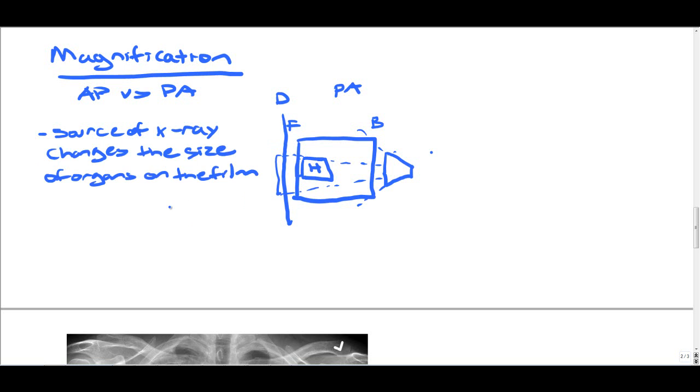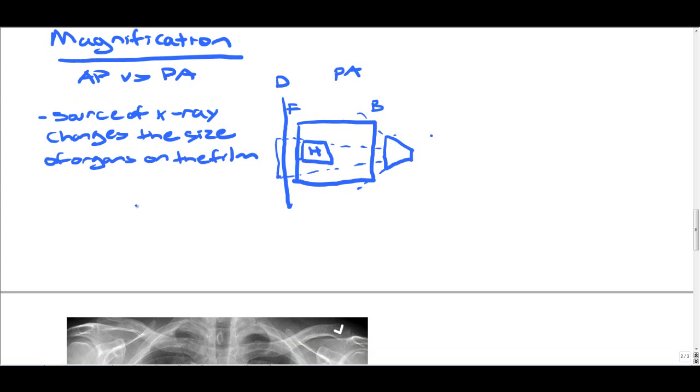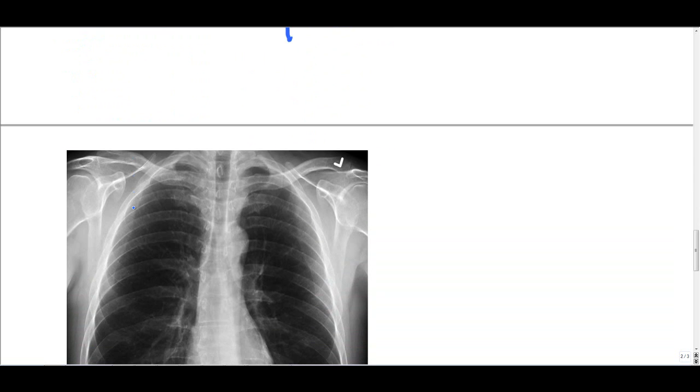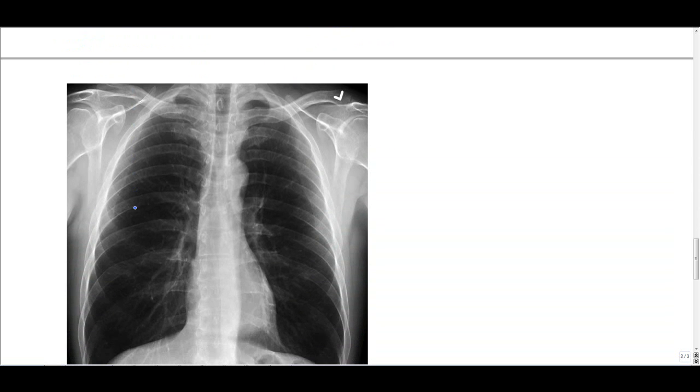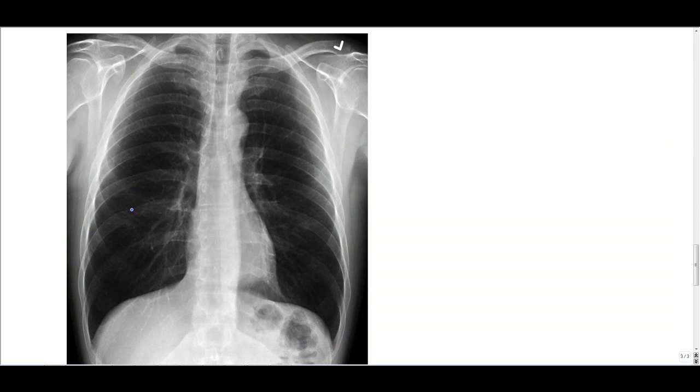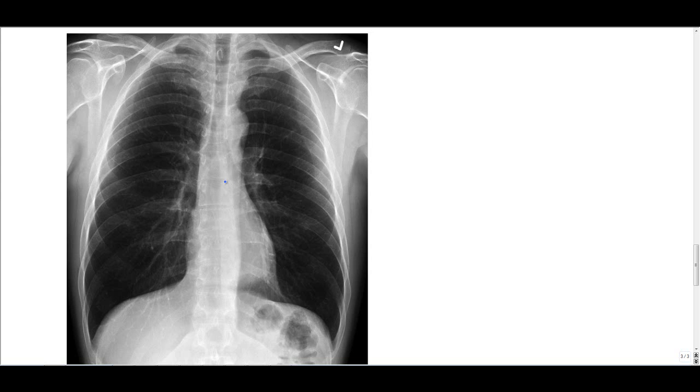Now, we've gone over all the factors that determine a good x-ray: penetration, inspiration, rotation, and magnification. Let's take an example and try to see if it's a good x-ray. So let's start with penetration. We're going to look for our spine sign. Can we see the spine through the cardiac silhouette? And yeah, I believe we can. You get a very nice spine sign here.